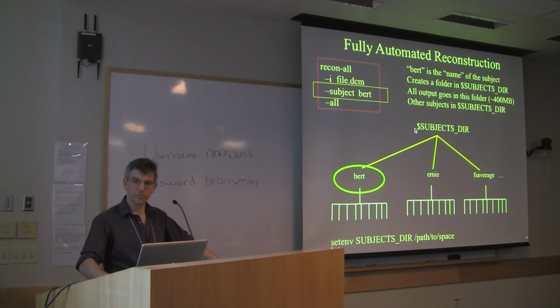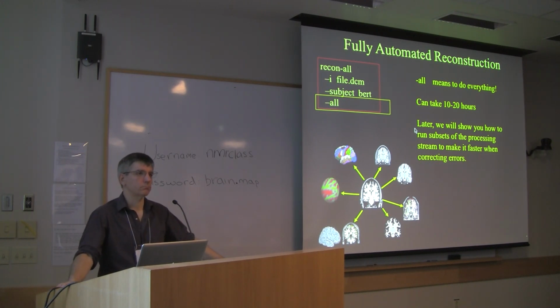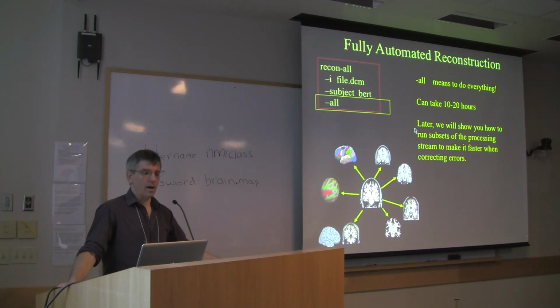But you might want more than one subject dir. So if you're doing multiple studies, you may want to separate them into different subject directories, and in that case, you will have to set them manually. The last flag is -all, and that tells it to do everything, which might sound a little bit redundant with recon-all. You would think it would just do everything based on its name.